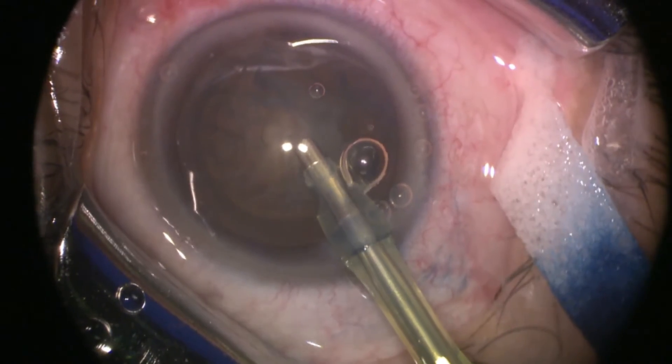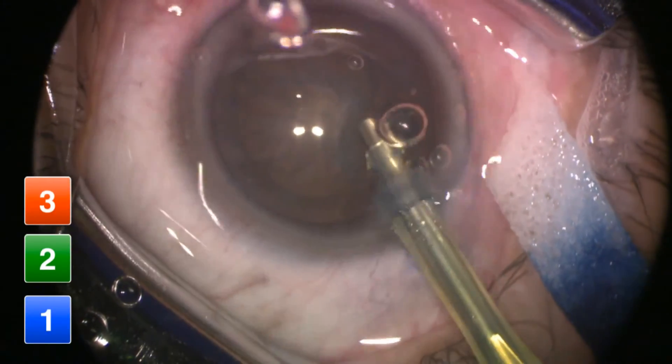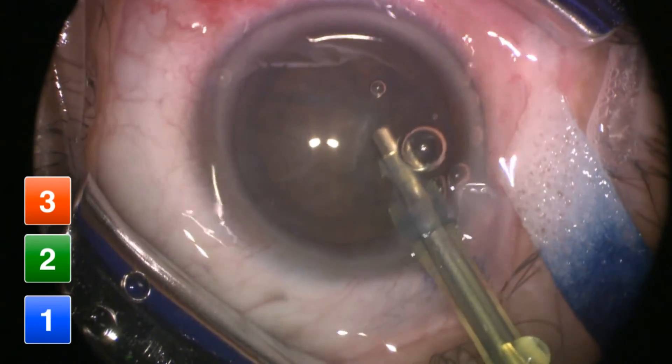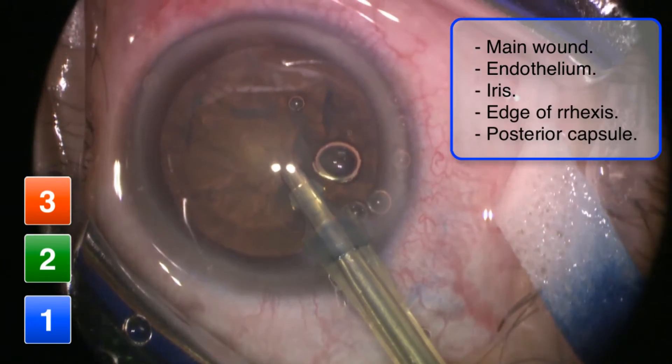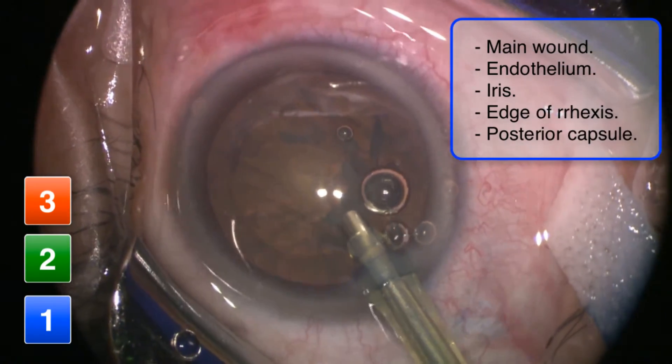While operating with the FACO probe on either aspiration or ultrasound, be careful not to go too close to structures that may be damaged, such as the main wound, the corneal endothelium, the iris, the edge of the rhexis, and the posterior capsule.